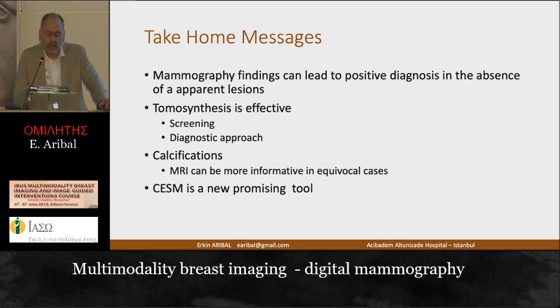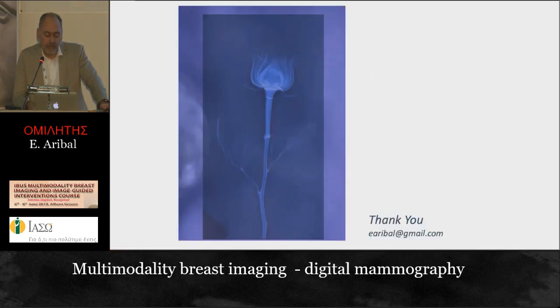MRI is more informative in equivocal cases, and in calcifications, adding MRI can help you understand the extent of the disease. CEM is a new promising tool that might not displace MRI, but can be used in cases where the patient cannot go under MRI.